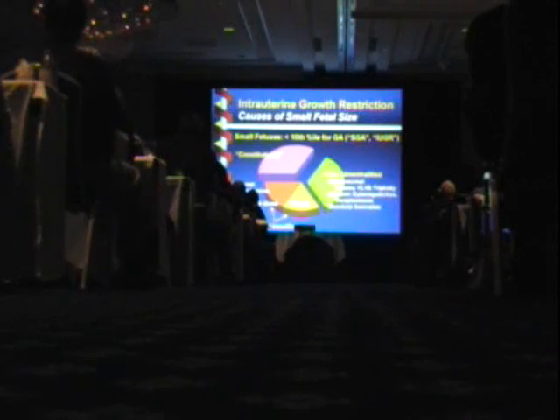They may be genetically small. There's nothing pathologically wrong with them. They just happen to be, 10% of us are in the bottom 10 percentile. It doesn't mean that we're pathologically small. Your job on ultrasound, once you've determined that the baby is below the 10th percentile, is to try as best as you can using ultrasound clues to determine whether that small baby that you found to be below the 10th percentile is constitutional. Well, you're not going to see signs of this.